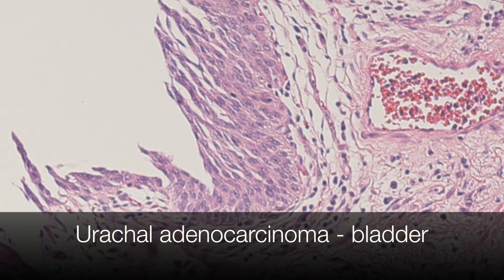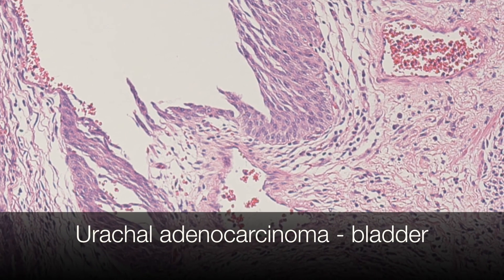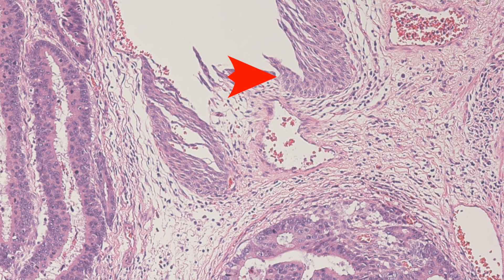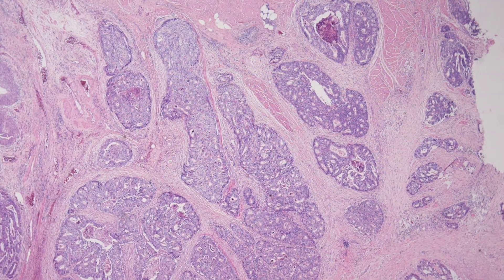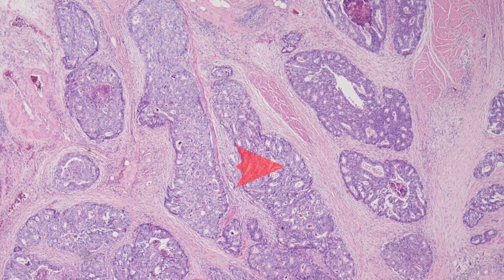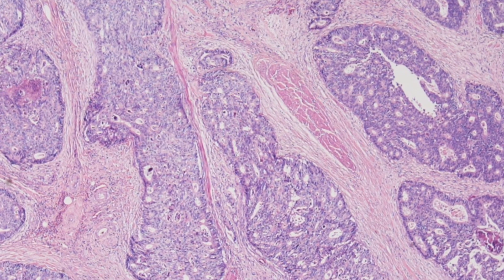This is the histological appearance of an enteric type of urachal adenocarcinoma that has arisen in the bladder. The urothelium is normal, and this contrasts sharply with the adjacent urachal adenocarcinoma, indicating that the tumour is not a locally arising urothelial carcinoma showing glandular differentiation.